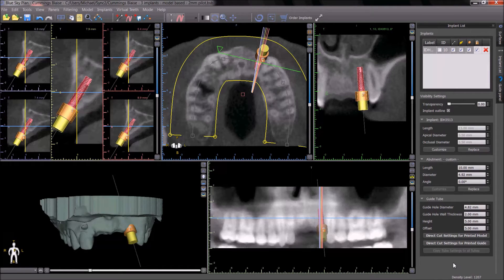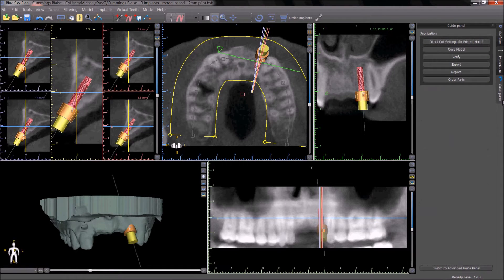The user should then go back to the guide panel and continue with the usual model-based surgical guide protocol as outlined in the tutorial on how to design a model-based surgical template.